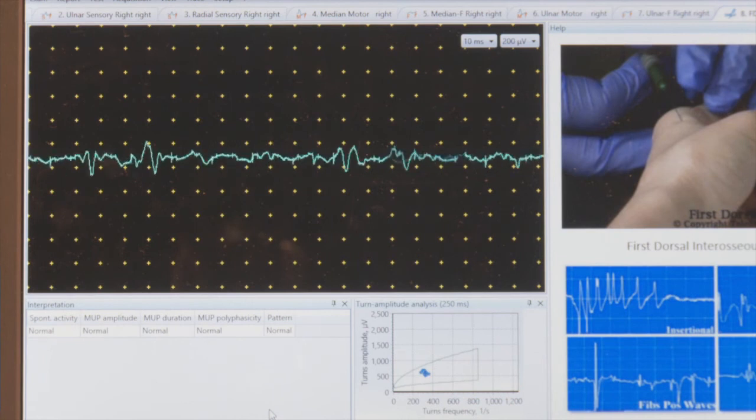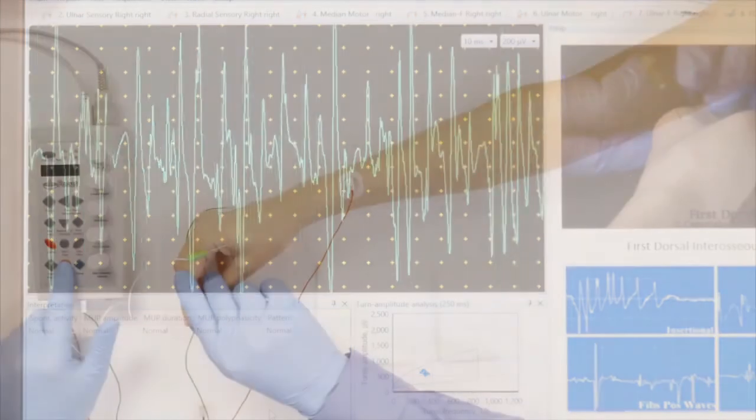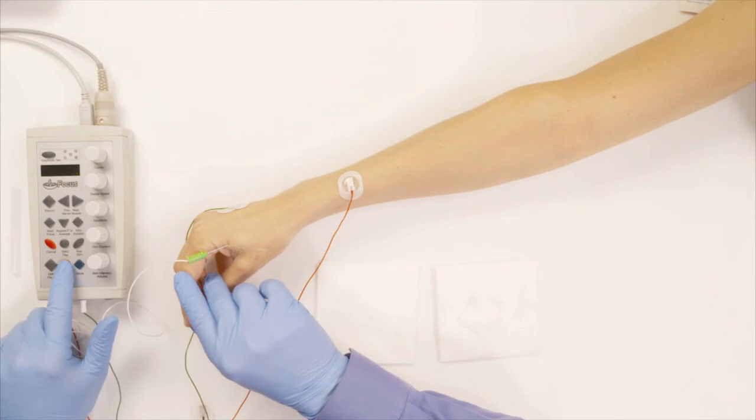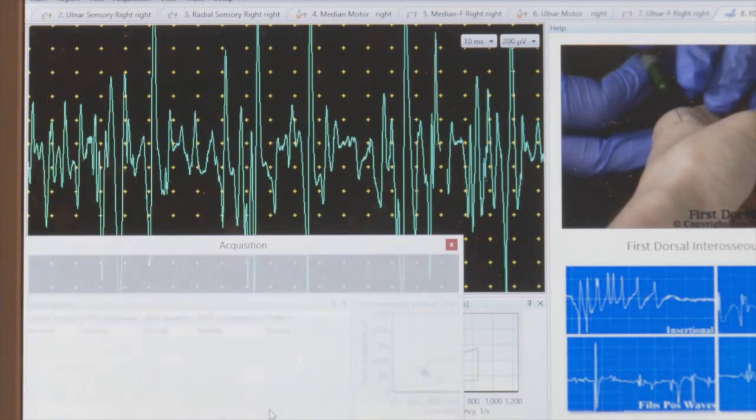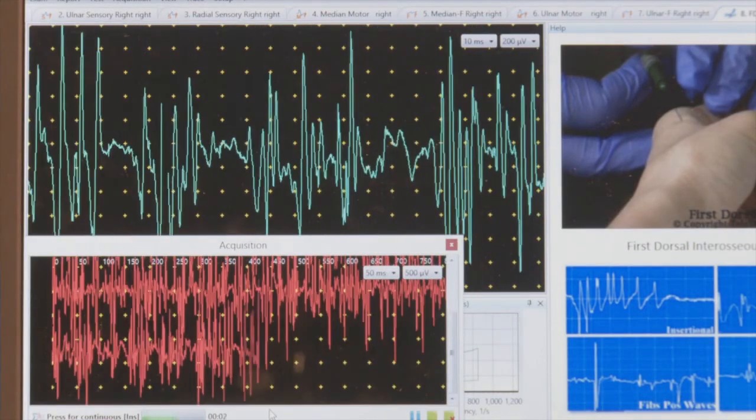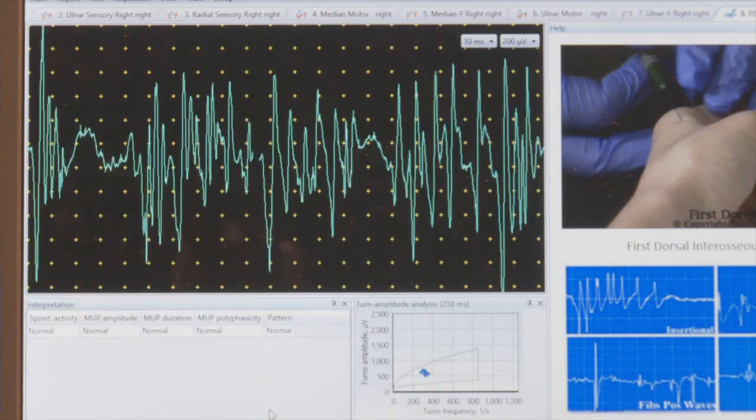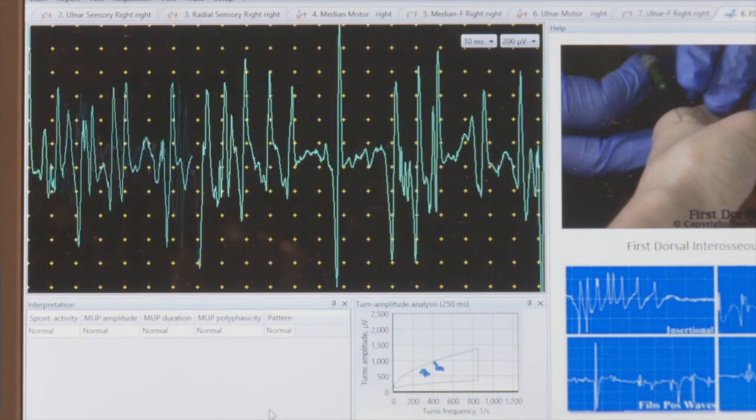The next level is I do moderate contraction. And again, I do exactly the same thing here. I press on the right. And as soon as the screen is filled, I press store. Now relax. And now you can see that there's more activity.